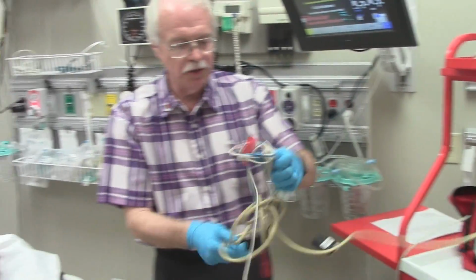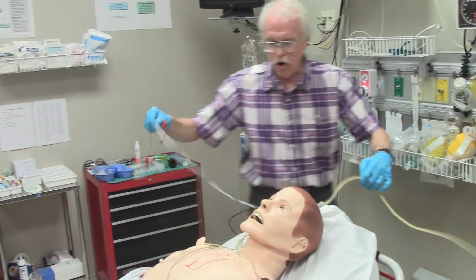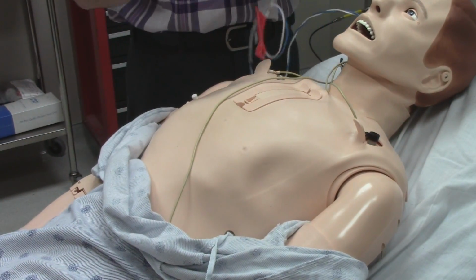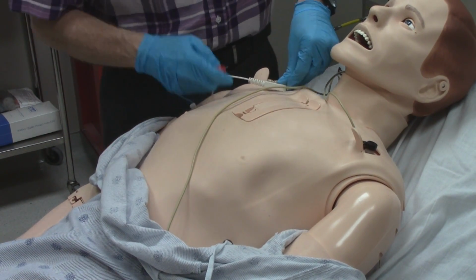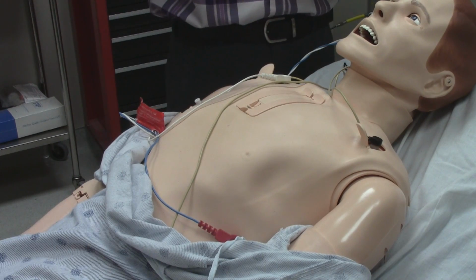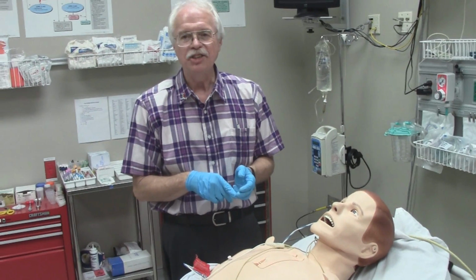The same is true of the defibrillator pacing cable. There are large posts on the patient's chest, here and here. To attach the pacing defib cable, simply snap the leads directly onto those large posts. You don't have to apply electrodes to the patient's chest. The patient can now be defibrillated, cardioverted, or paced.